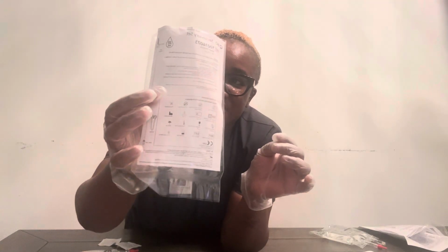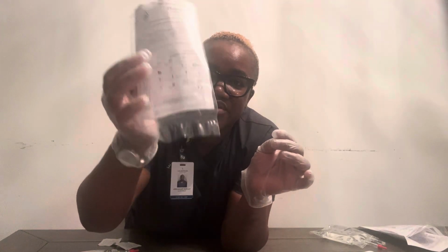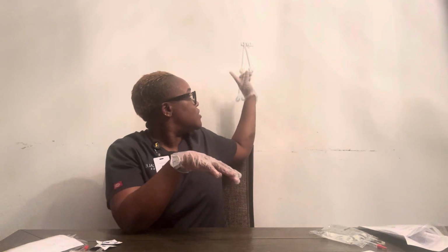And for this, my macro drop set is 20 drops per ml. I have my alcohol pads, and I have my piggyback hanger here.